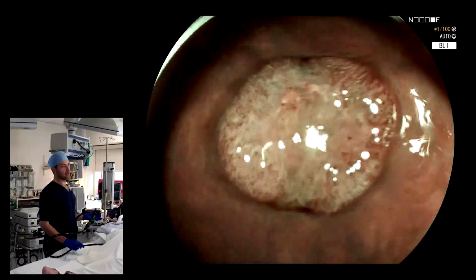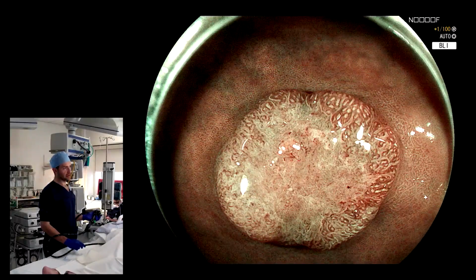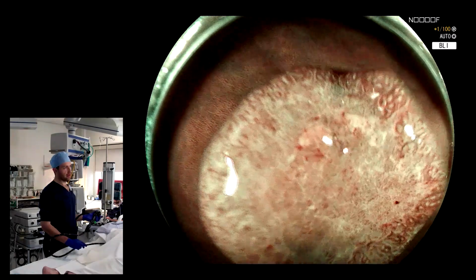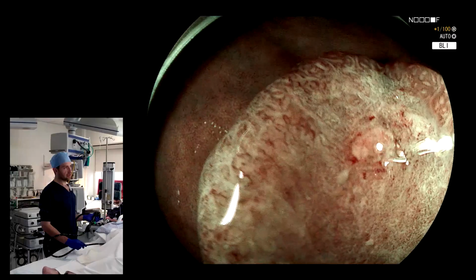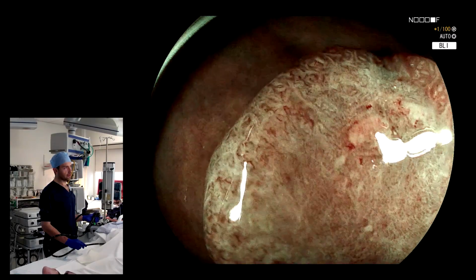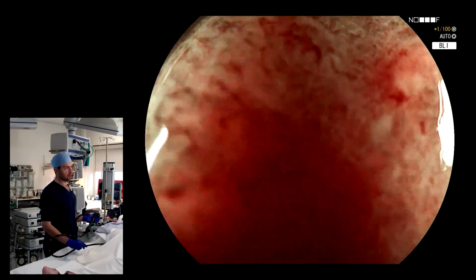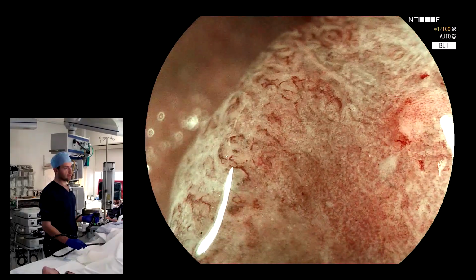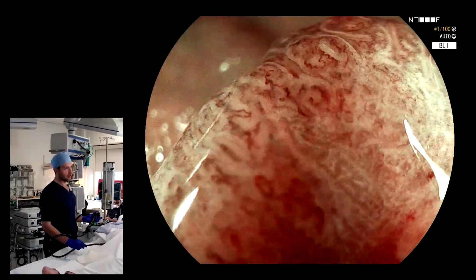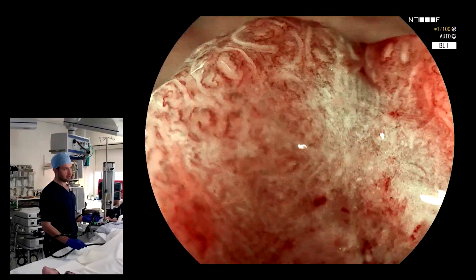The first technique is to get a nice overview. You can clearly see the whole demarcation zone here. But then as you come closer, we can see beautifully here the demarcation line, and then we can get even closer. But one of the problems is that you need a cap or you need water, because this is a nice view, but to get more information from this image and to get closer, we need to freeze the focal length. And that immobilizes the distance between the endoscope lens and the polyp.